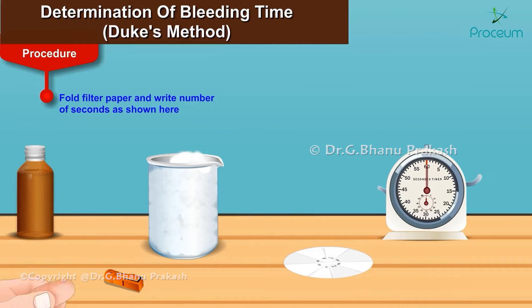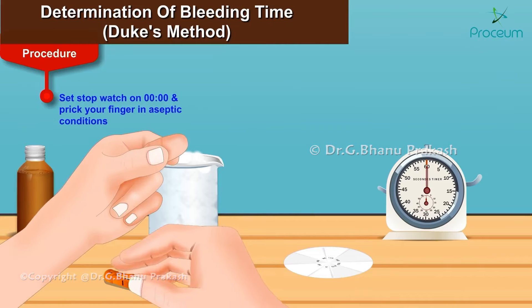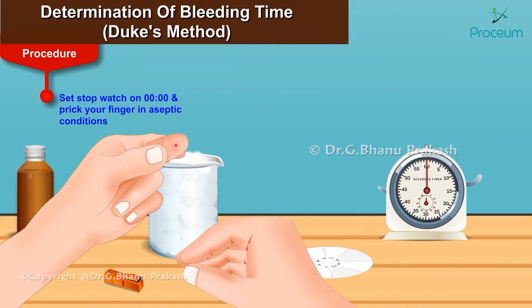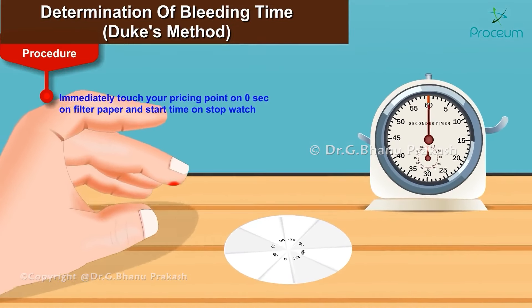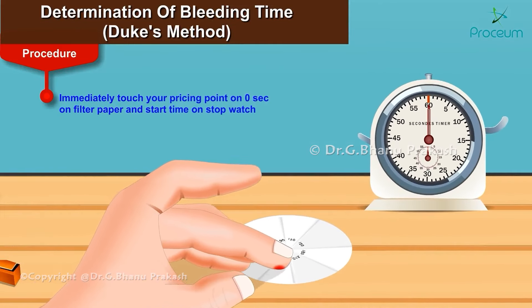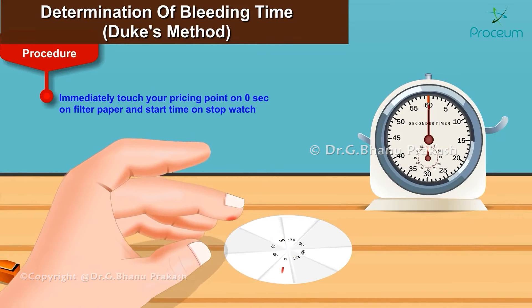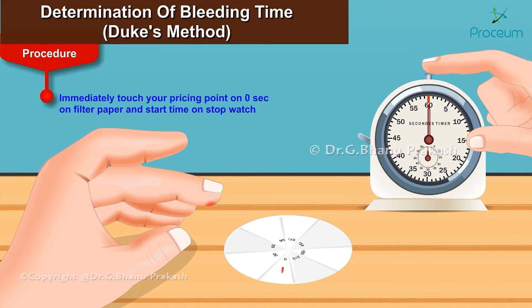Set the stopwatch on 0 and prick your finger under aseptic conditions. Immediately touch your pricking point on the finger on 0 seconds of the filter paper and start the stopwatch.